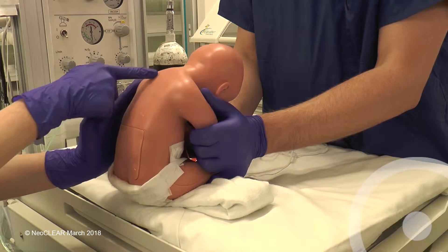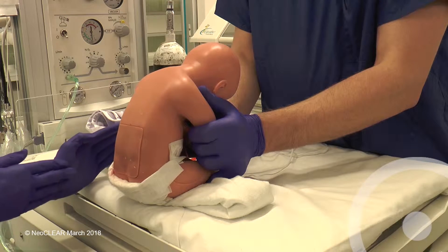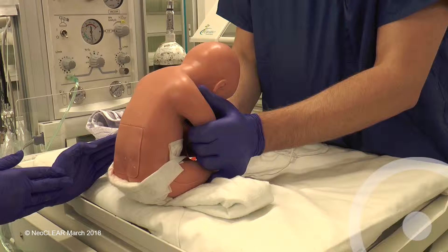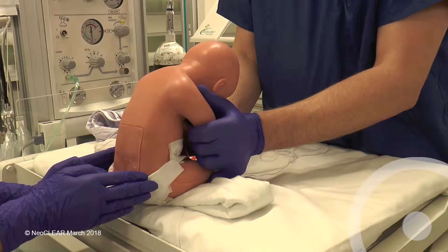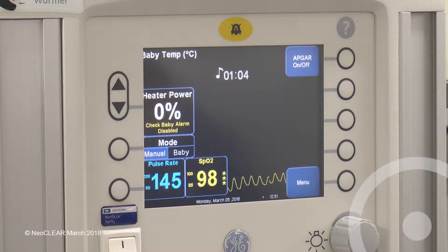For a sitting lumbar puncture, the infant should be held upright with the spine curved forward but straight in a vertical line. The knees and hips should be flexed as much as possible and the head allowed to rest forwards on a folded sheet or towel if needed. The second assistant should be checking the monitor throughout for the lowest and highest heart rate and for the lowest SATS with a reliable trace. The procedure can be stopped or paused if the baby is felt to be compromised.